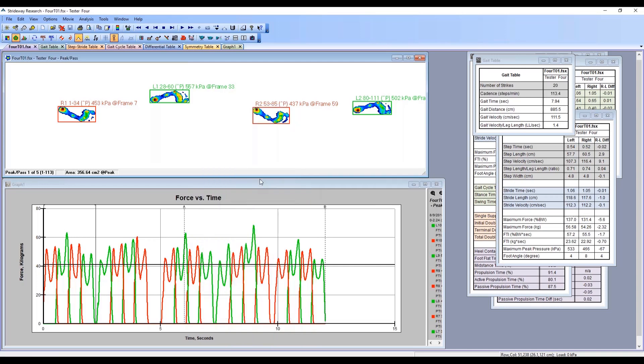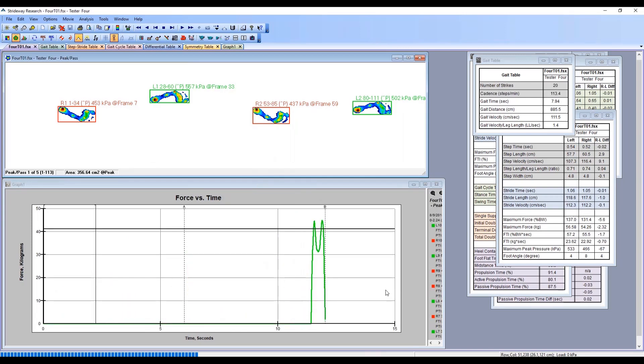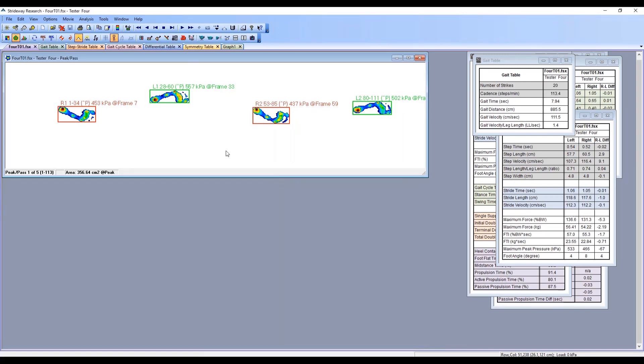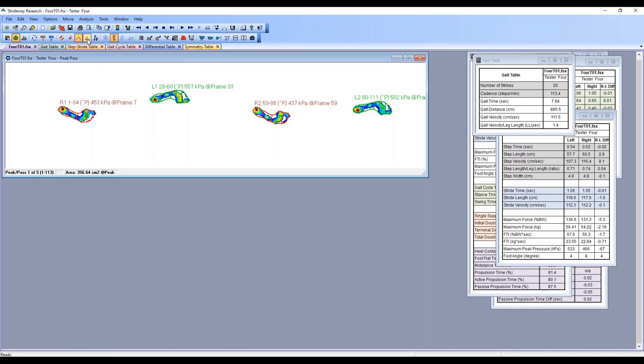If you do a right click on your window, we can convert the strike boxes to templates. You'll see that now rather than having a box around the foot strike, it actually has the form of the foot. We've got a box here for the heel, a box for the metatarsal heads, and then we still have the one around the total foot. We can go and do an average for this.